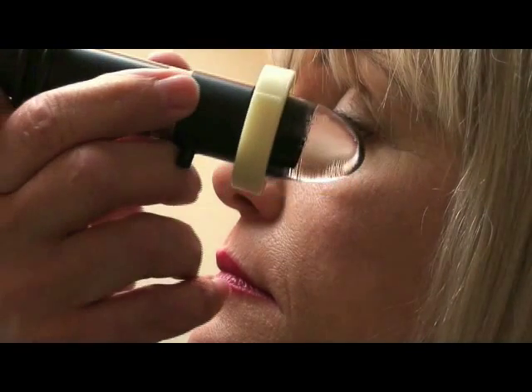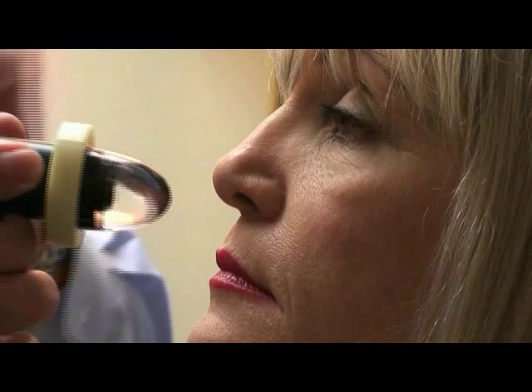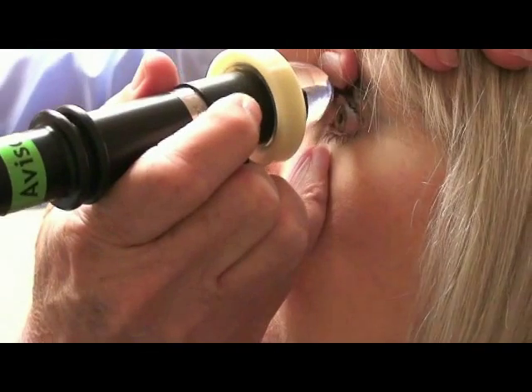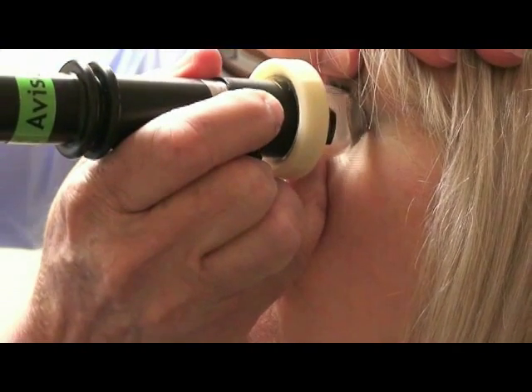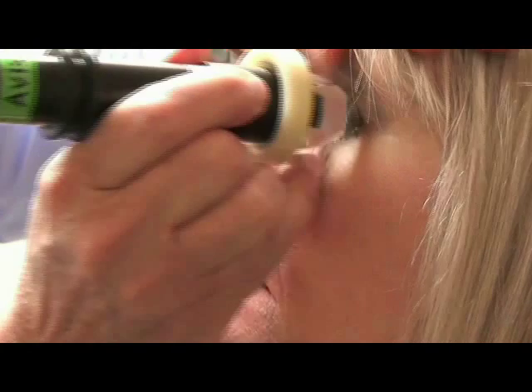When examining angles, the probe line is directed toward the cornea. To scan the temporal angle, have the patient look slightly nasal — 3 o'clock in the right eye. When examining the inferior angle, the patient looks slightly superior — 12 o'clock. For the nasal angle, the patient looks slightly temporal — 9 o'clock. When examining the superior angle, the patient looks slightly downward toward 6 o'clock.